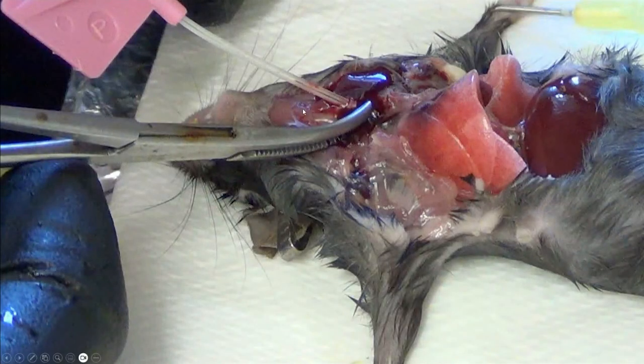As the trachea is opened and visible, you will cut a slit in the trachea that creates about a 40% opening inside the trachea, and insert this catheter tube inside, and then clamp it with an instrument, a stainless steel instrument like this.